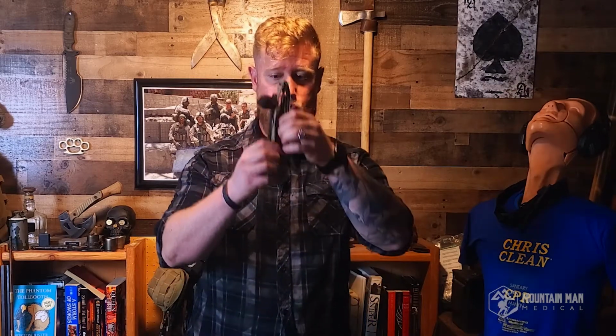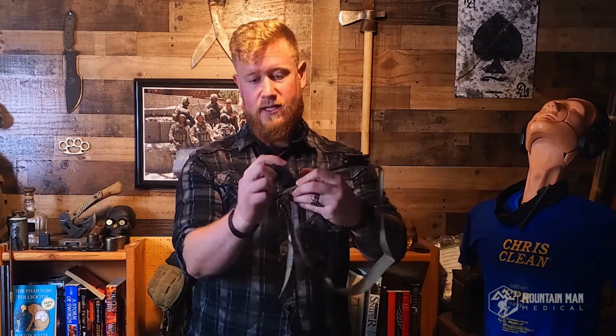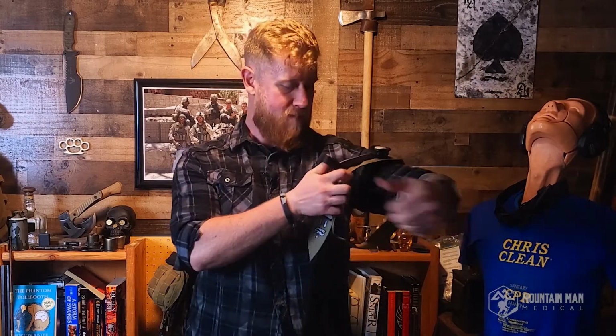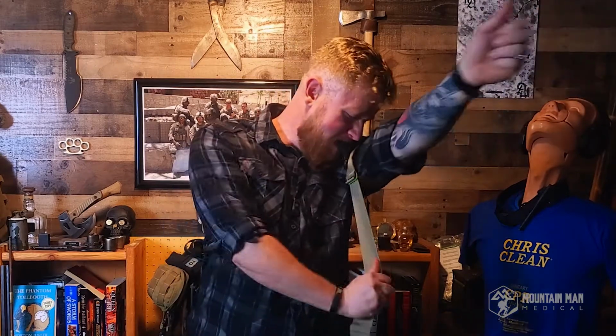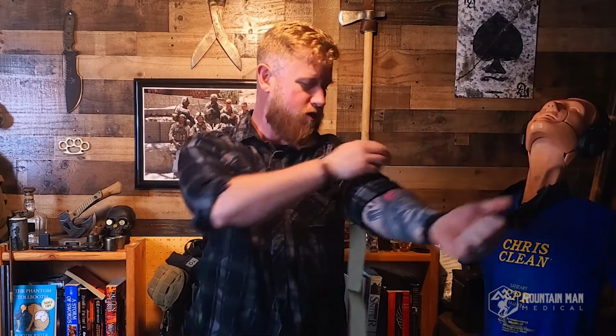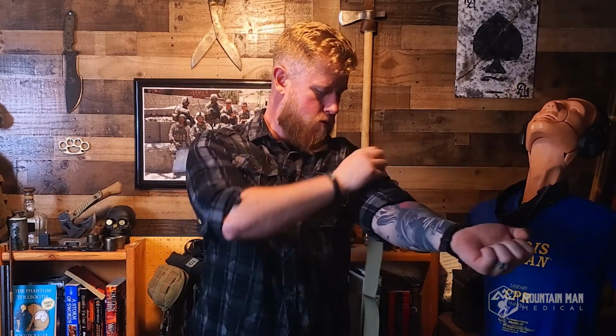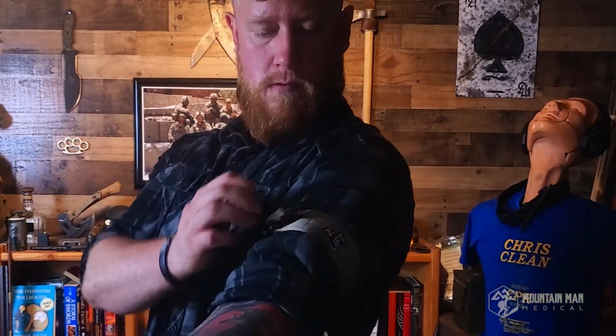So what we're going to do, we're going to drop this open. Going to loop it around. I'm going to position this loop closer to my face so I can grab it with my teeth. And then I'm just going to pull on the strap and tighten it down. I'm going to try to get it as tight as I can first before I start to ratchet it. And now I'm just going to start cranking at it. And just like with the CAT tourniquet or the SOF-T Wide, we're going to keep cranking on this until we get full occlusion of the artery.